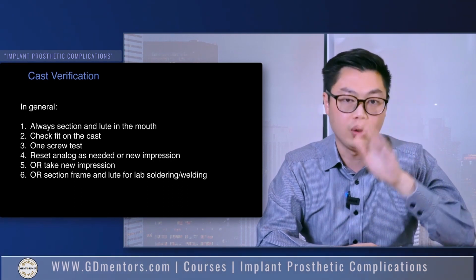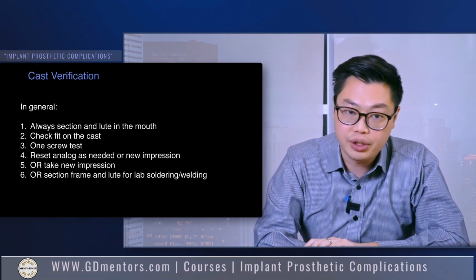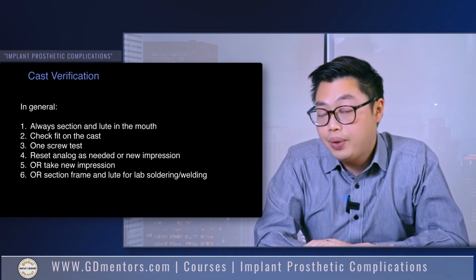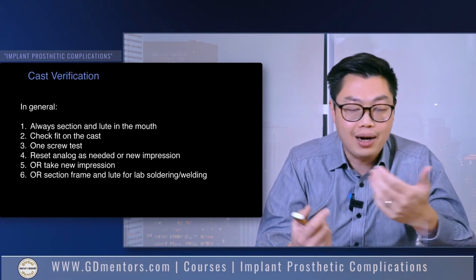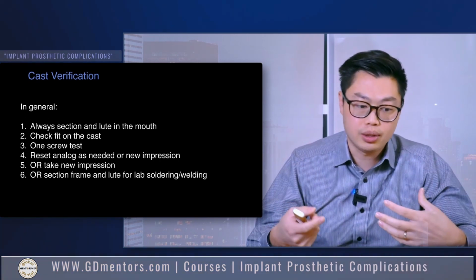or pattern resin, or flowable. Obviously, you have to dig out a hole big enough so that the analog can fit in passively. If you can't figure out which analog is off, then sometimes it's best to just retake impressions.